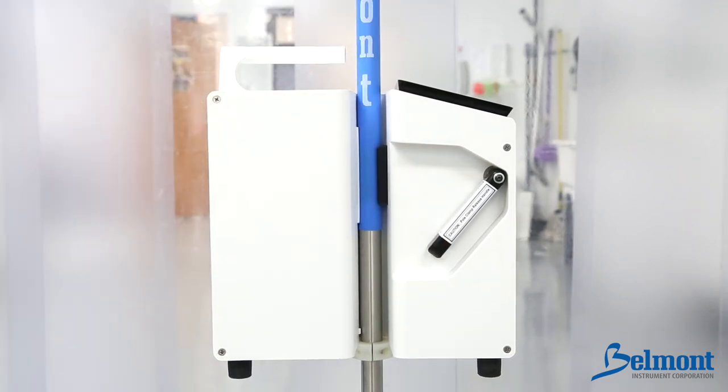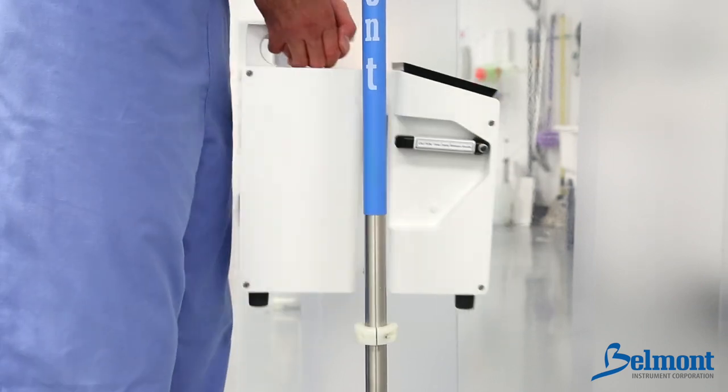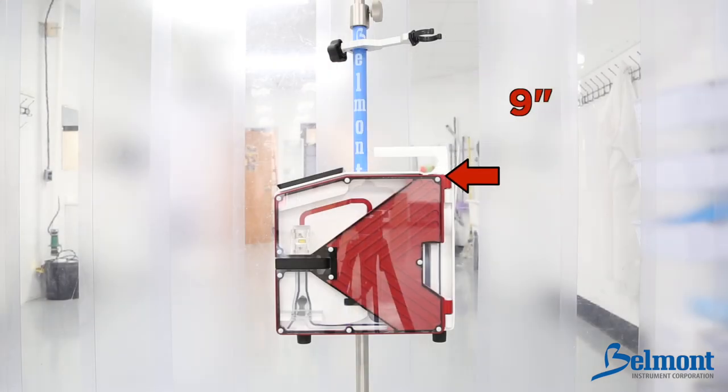To remove the system, lift up on the pole release clamp while holding onto the top handle. This will prevent the system from falling. Install the small reservoir support approximately nine inches above the top of the system.